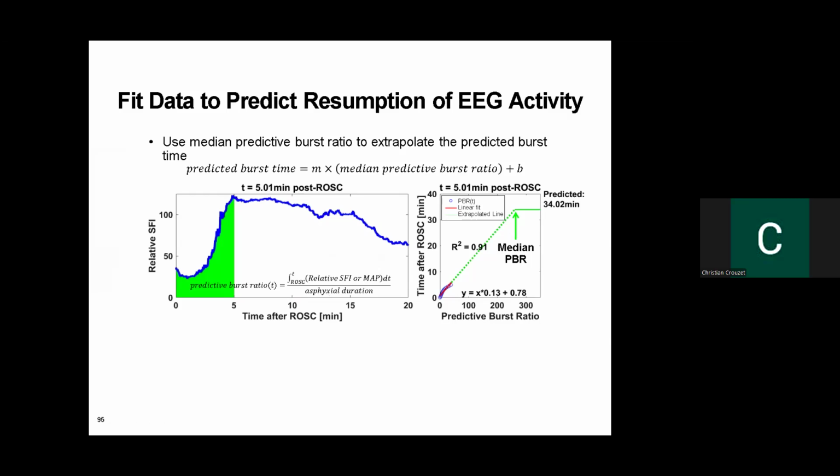This was the second iteration. This actually isn't in what we published because I modified it later and it got more accurate by having a dynamic fitting method as opposed to effectively the same bounds all the time. So yeah, it's actually for 5 and 7 minutes, this approach.